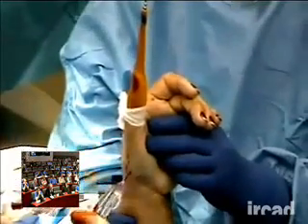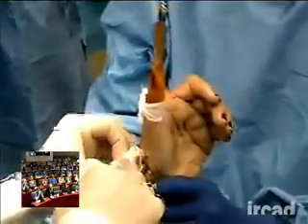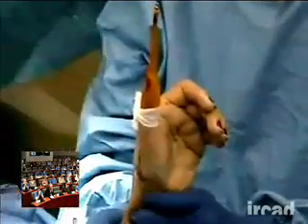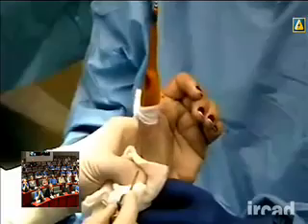So we introduce a little fluid just to distend the joint. Nice. Brachial plexus anesthesia? No, wrist block. Can you show us the metacarpal? I need these lights out of here. They're distracting me. Okay, there's the metacarpal, which also has loss.